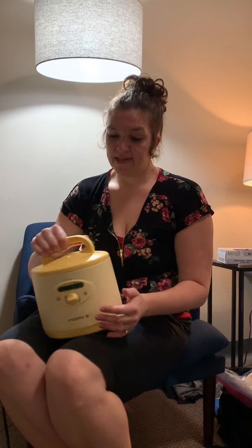The thing that I like about this pump is it's a closed system. It has a really good motor and engine in it, it can be used across multiple women, and it gets a pretty good suction.